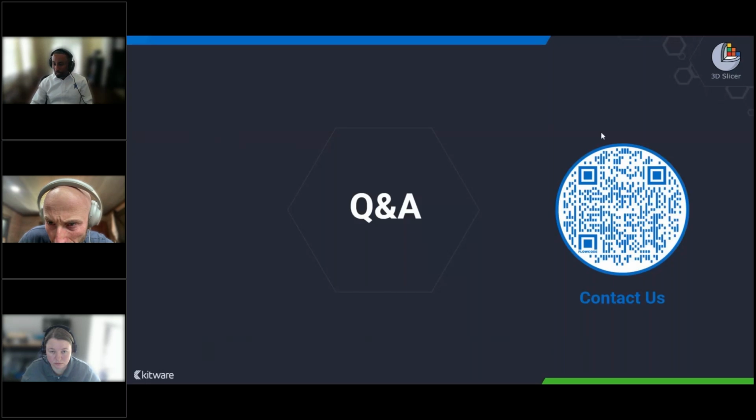So with that, let's see. Are there any questions, Sam and JC, that we should address? So I think, JC, if you're able to answer these, we've had a handful of questions about VR and AR stuff. Is there a question that would be useful for the broader audience? Mainly current questions about current plans for VR and AR support. Okay, pretty high level. Yeah, JC, you want to address that?